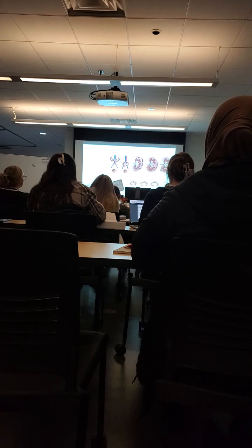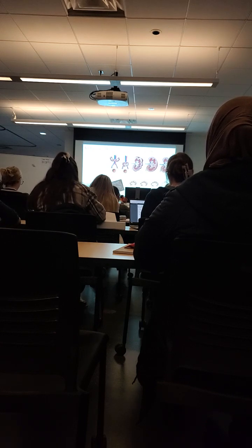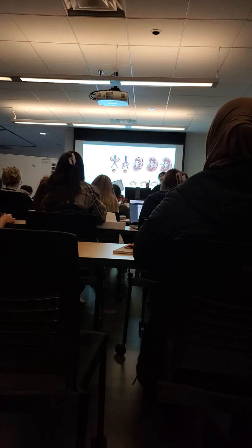Echogenicity, because if it's atrophied or they're in chronic kidney failure, then it's going to be a little echogenic. It is not going to be the beautiful, hypoechoic color. It is going to be bright. And you're going to be like, what? Because it's going to look like the sinus. Sometimes it's so shriveled and atrophied that you can't see anything. And you're like, where is this kidney?